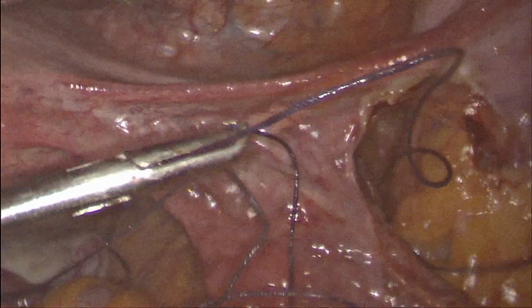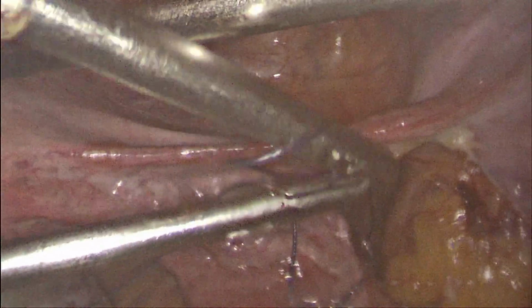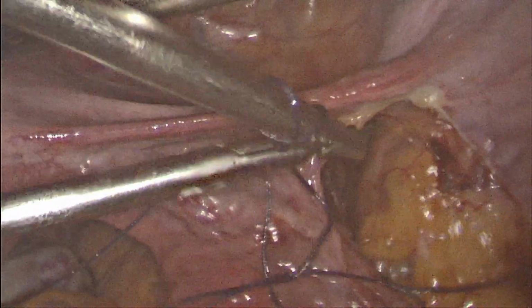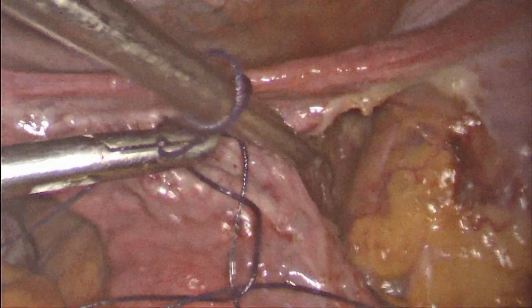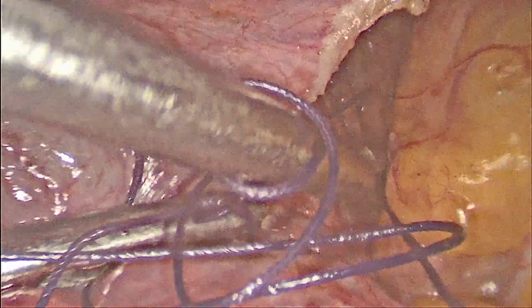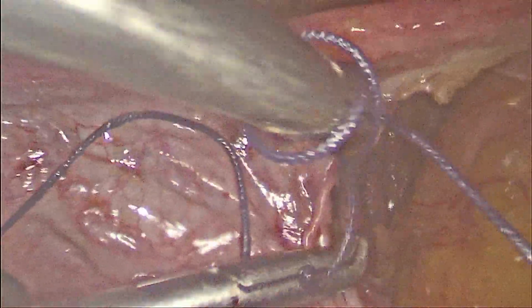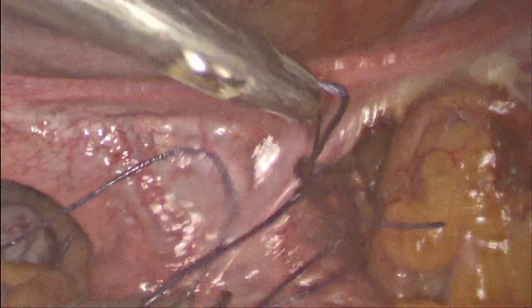To tie the shoelace pattern, the free end of the suture should be held a little longer, and then the short end of the suture should be held midway, not at the tail end of the short stitch.